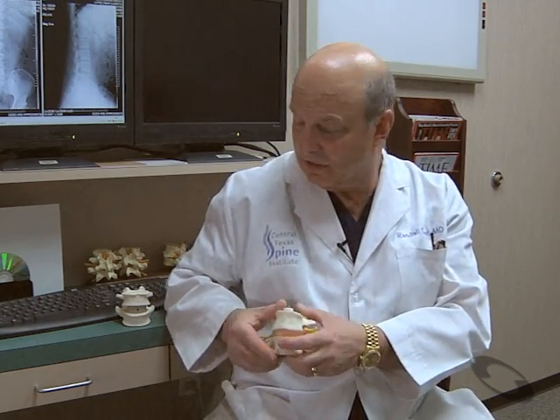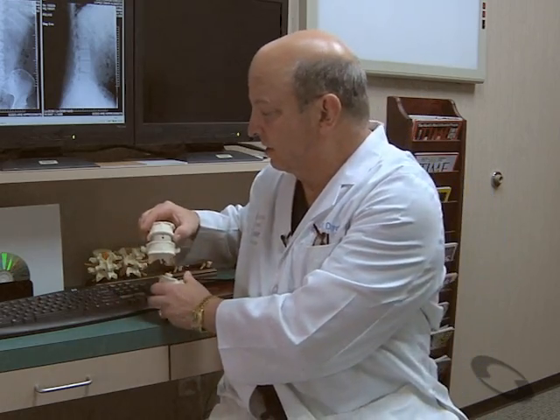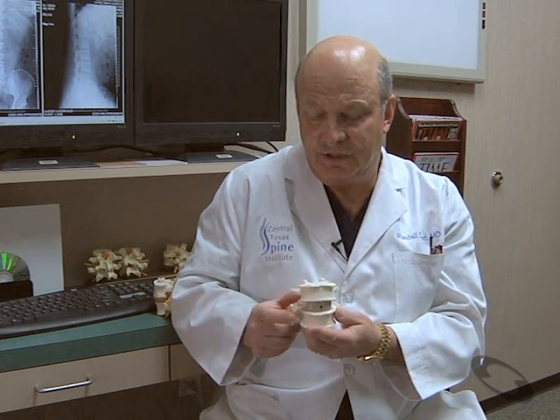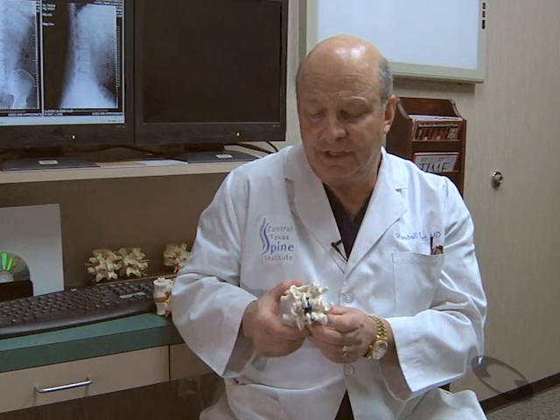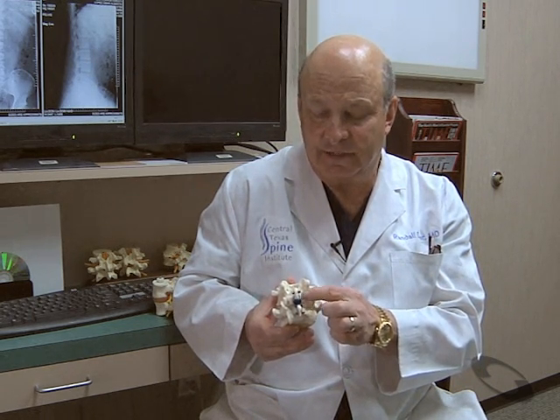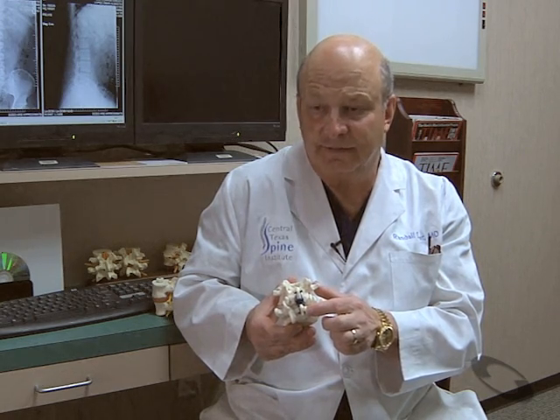Other places where I've used it is to augment an anterior lumbar interbody fusion, which is what we're doing in this particular surgical procedure today. We will do an anterior procedure, and then I can do a posterior decompression and add significant stability by adding the spinous process fixation with the coflex-F.